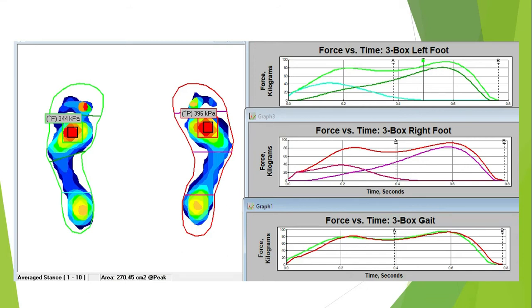As we look at the averages of those steps, we have 344 kPa in the left, 396 in the right. And you see back on the left, there's a heavier loading through the left distal hallux.